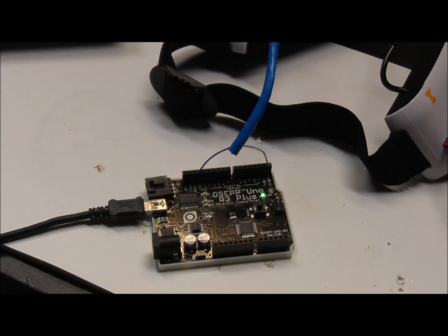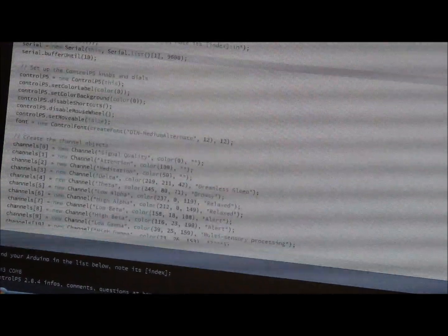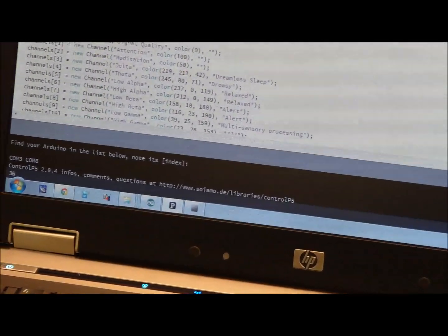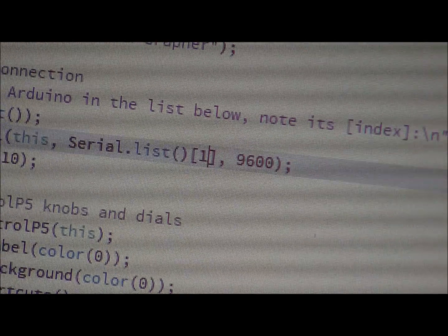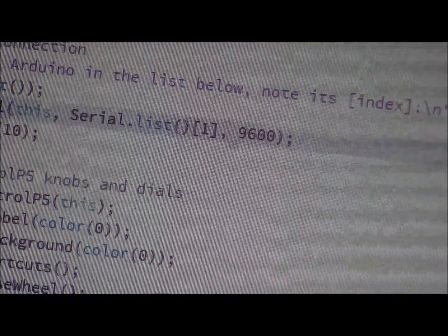Well, having a little bit of trouble here getting this to work. What I have is the Processing program open, all downloaded, got the library imported, everything looked good. It tells you to note your COM port in the index. So with it default, with my COM port, it didn't do anything. So this digit here, I found if I change that to a 1 instead of a 0, well, I could see Arduino talking. I'm getting data moving, but this is what I get on the display if I pull up the graph. When you hit run in Processing, I get nothing. So anyway, I'm going to keep working through it. Thought I'd show that. Hopefully I can find the solution.